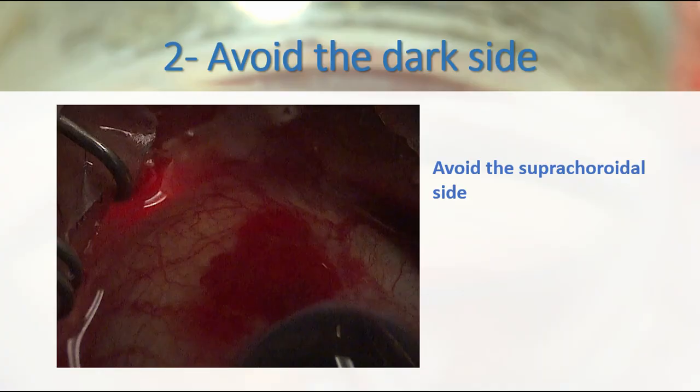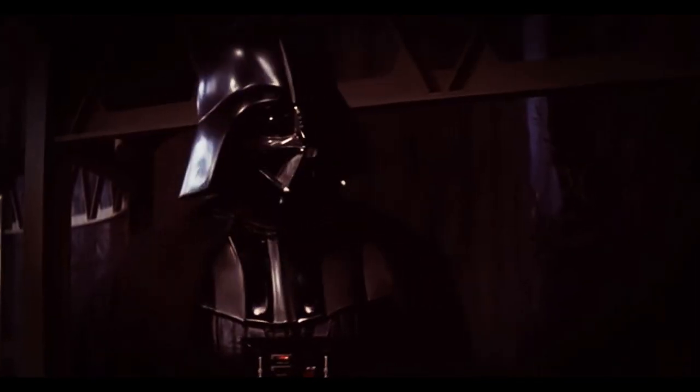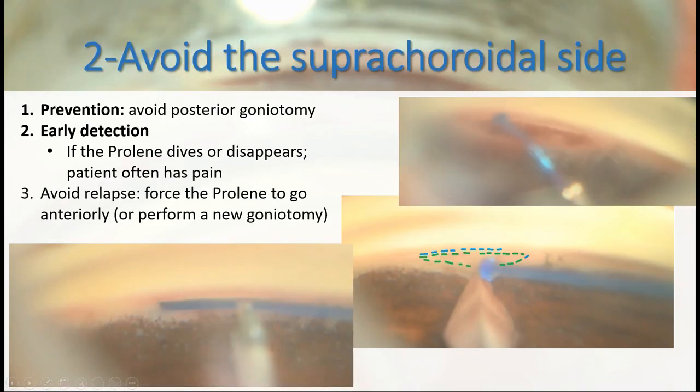A second pearl would be to avoid going to the suprachoroidal side. Don't go into the dark side. In this video, we can see that the tip of the Prolene suture immediately dives down. In these cases, first we clear out the view of the associated hemorrhage. We perform, if needed, an anterior goniotomy and we try to direct the Prolene suture as anterior as possible.